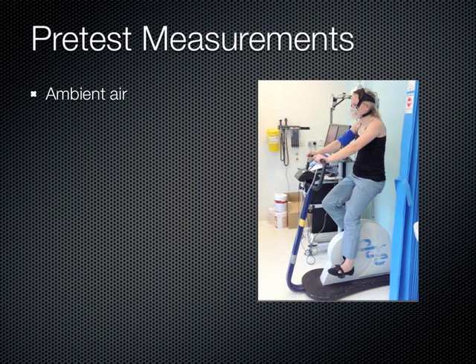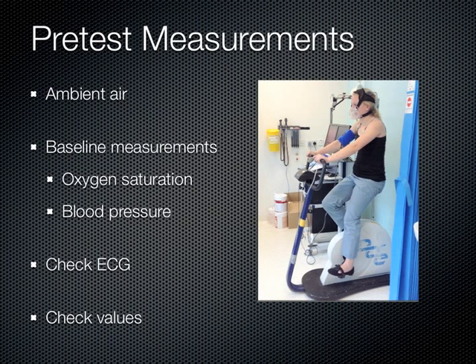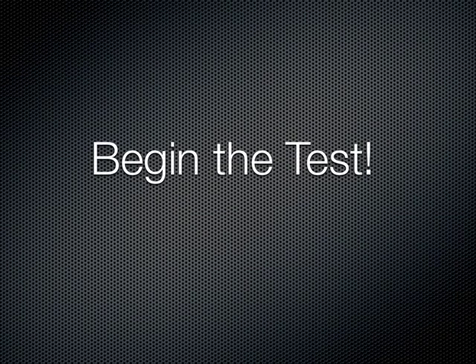Set the patient on the ergometer and measure the ambient air. After attaching the saturation probe and blood pressure cuff, take a baseline measurement. Do not begin the test if the patient's heart rate is above 125 beats per minute, systolic blood pressure is over 200, or diastolic blood pressure is above 110 at rest. Attach the 12-lead ECG and the soft rubber mask. Press the blue play button to begin the preliminary recording to check if the ECG is working and looks normal. Check the oxygen values: is the respiratory exchange ratio between 0.7 and 1? Is the VO2 between 2.5 and 6 milliliters per kilogram per minute at rest? Once you are satisfied with the preliminary recording, press the green play button to begin the test.